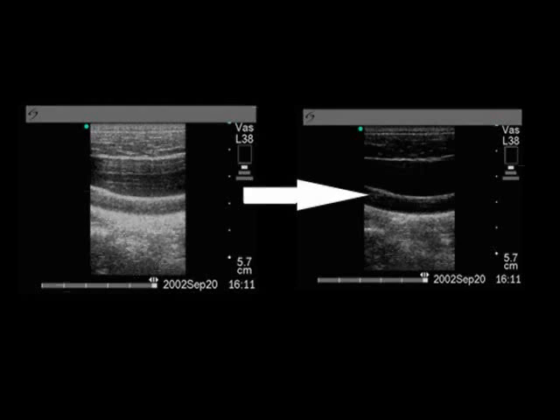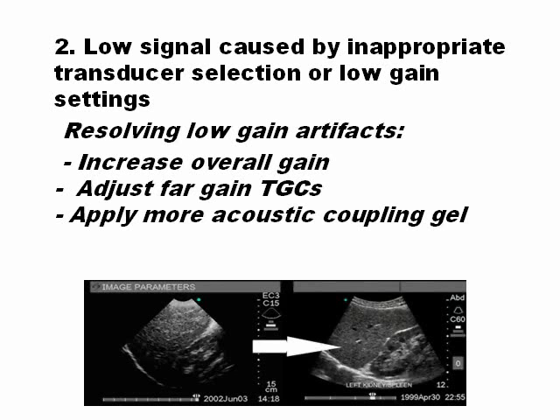Here you can see two pictures: the left picture has too much gain. Low signal caused by inappropriate transducer selection or low gain settings is also an issue. In this case, you can see the time gain compensation is very low in the deep areas, so you cannot see the parenchyma of the liver in the deeper areas. But time gain compensation itself can produce artifacts.